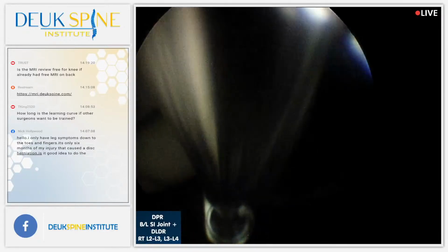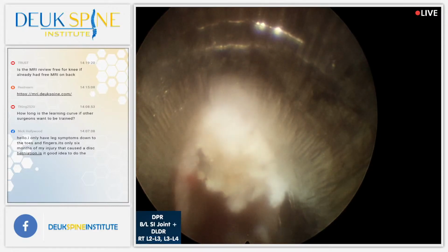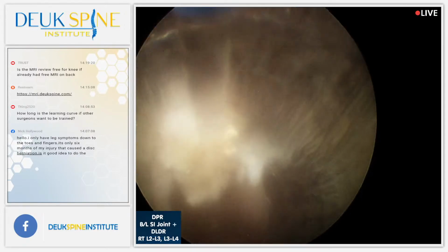Hold it. That's a little bone spur. So they didn't miss a single day of work, and 100% of their knee pain went away with the surgery, with the procedure. It's called the Duke plasma rhizotomy.